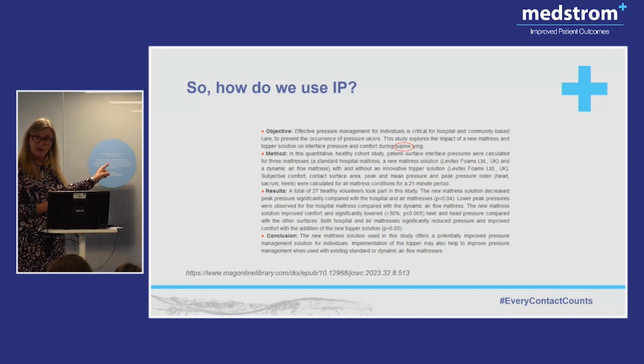Do you lie your patients supine, flat on the back much? So is it relevant to your patients? These are healthy people. Are they like your patients? Is their ability to move, fidget, the same as your patients?